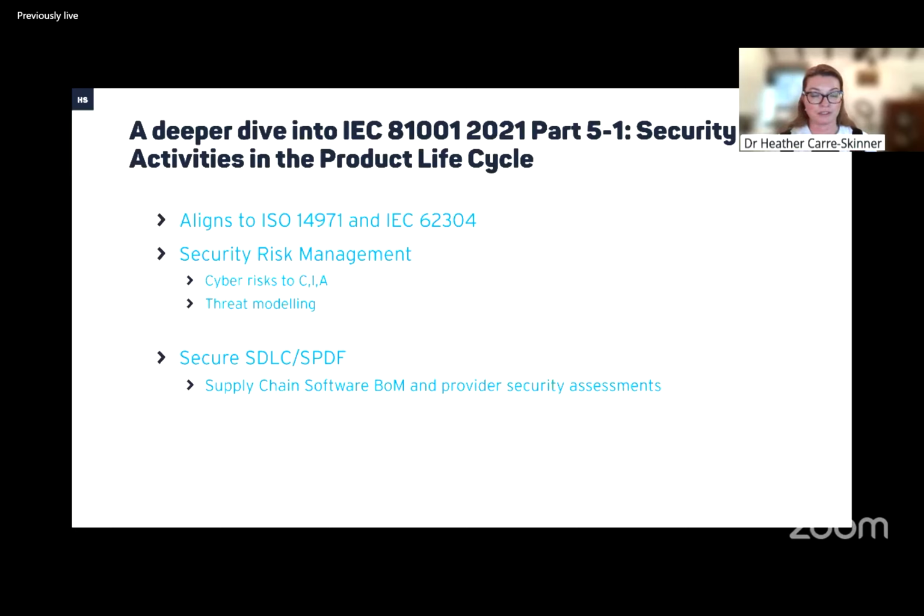development for medical devices. As I said, it really looks at security within the risk management framework, looking at risks to the device as well as risks to confidentiality, integrity, availability of data, as well as threat modeling. So it really does pin down this secure software development life cycle or secure product development framework.